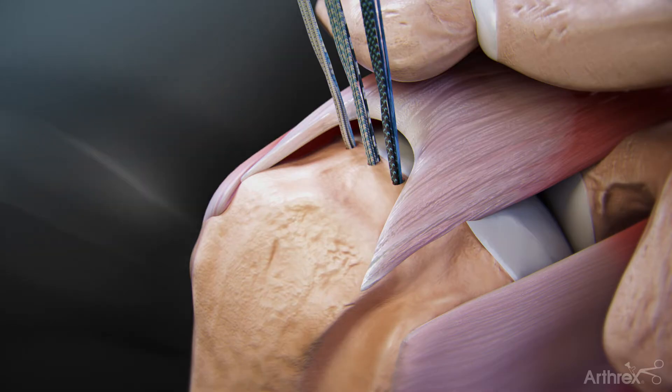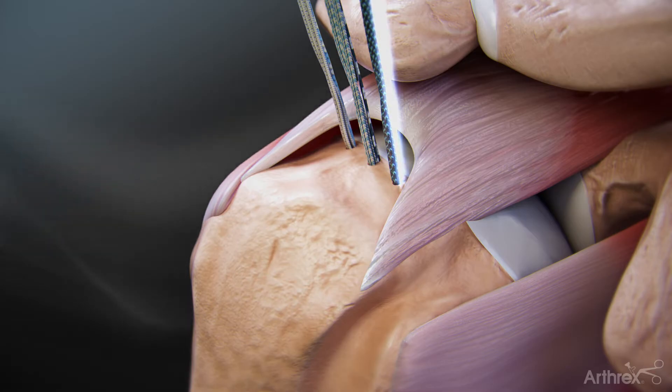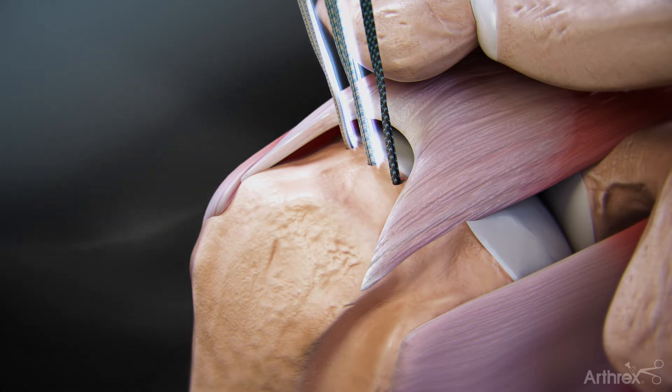These anchors are preloaded with a suture tape that can be incorporated into the repair or removed if not needed. To remove the sliding suture tape, grab one end and unload the suture from the anchor. Repeat this step for the other anchors.